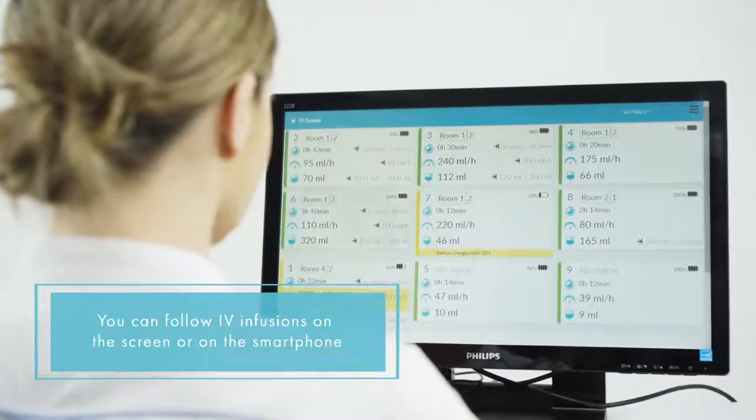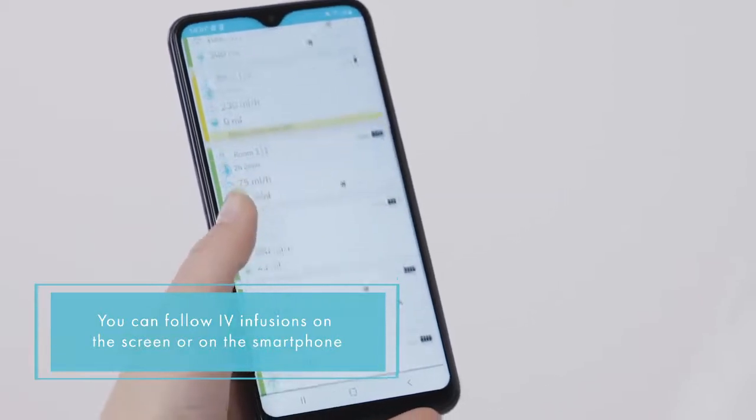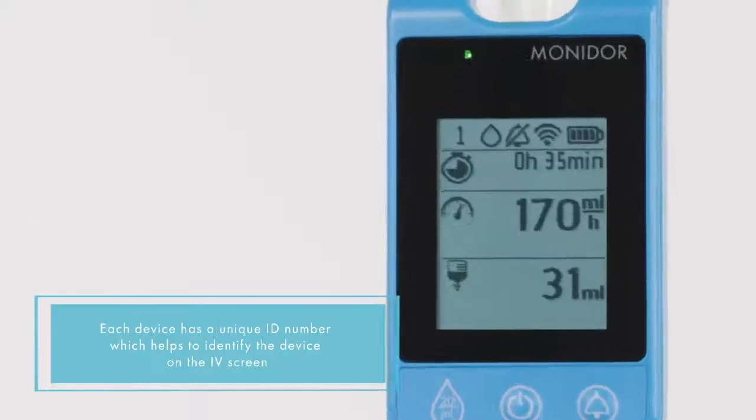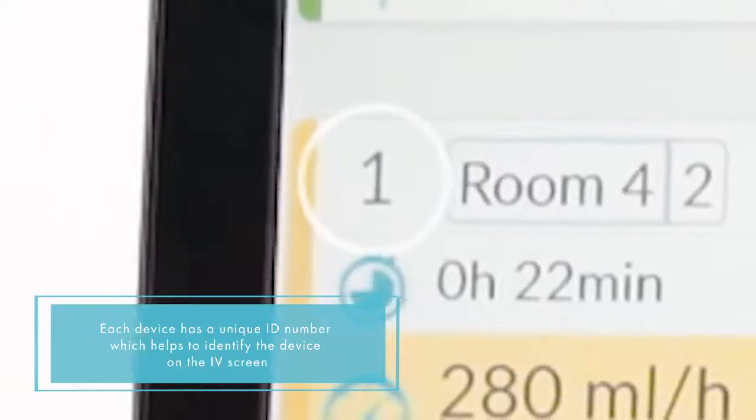When the MoniDrop is switched on, the device data appears automatically on the remote monitoring IV screen. Each device has a unique ID number, which helps to identify the device on the IV screen.